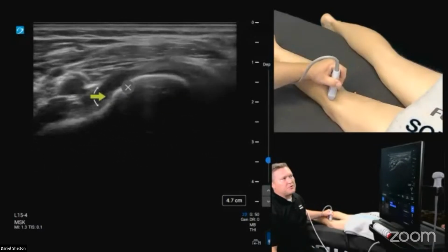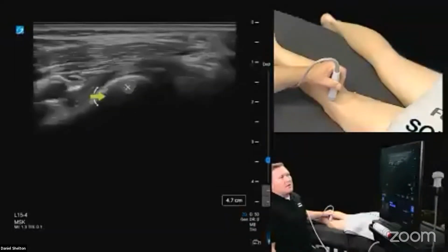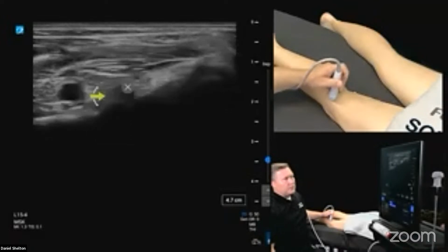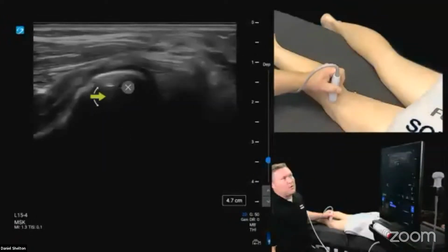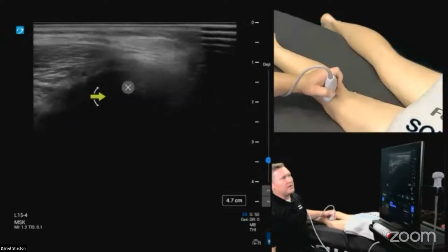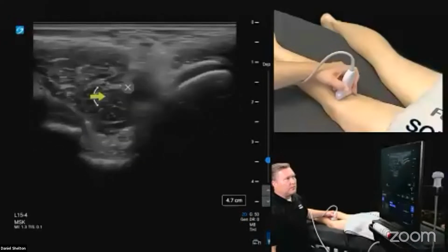But yeah, in general, if nobody has any questions, it's a pretty short subject, kind of like when we did the superior shoulder. You've got the AC joint and suprascapular notch and just a few other things that are considered normal scanning windows, but the rest of it are kind of obscure, and you can get lost in the weeds with anatomy for sure, and how much of it's clinically relevant or not is also up for debate.